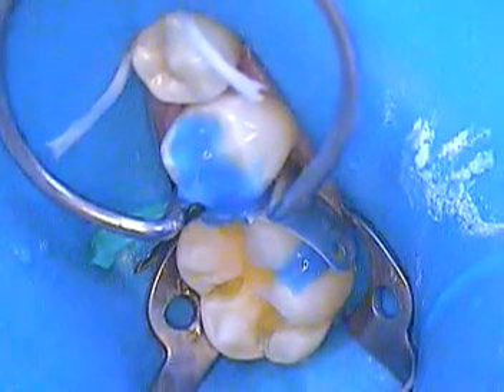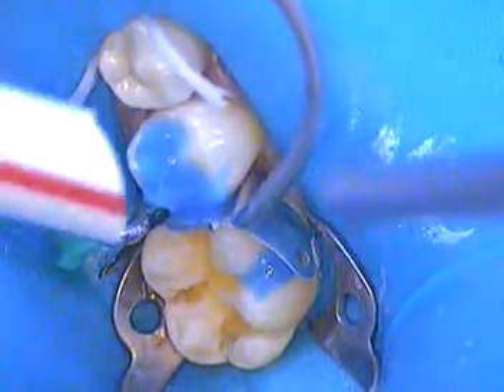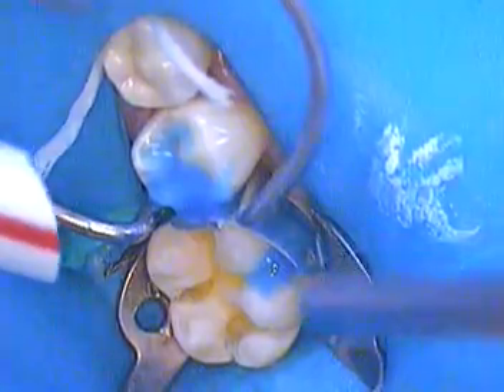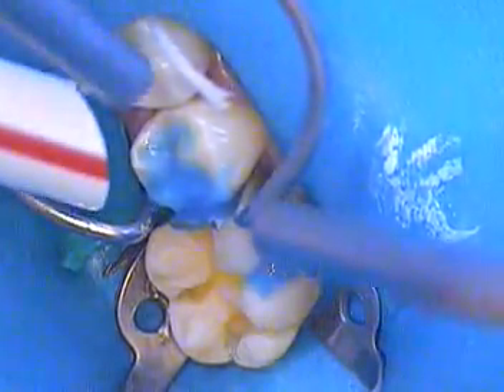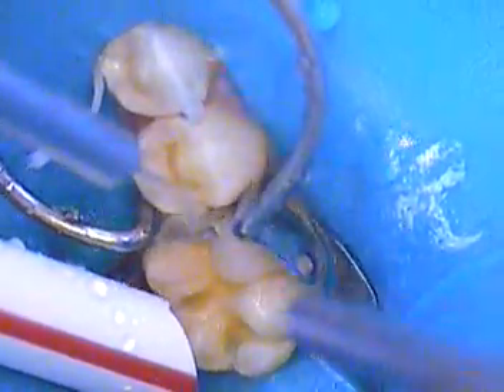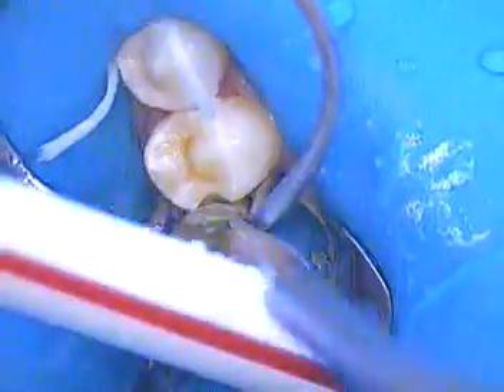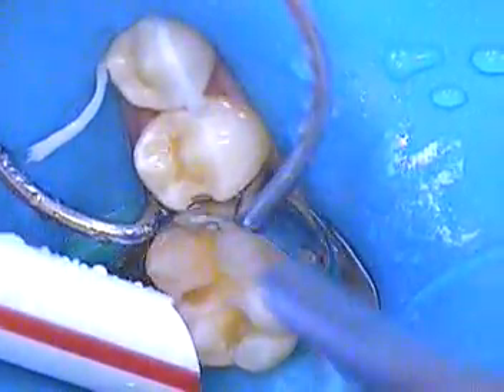We are isolated with the rubber dam and our methods are very conservative. You're now seeing the molar all cleaned out, the bicuspid all cleaned out thoroughly, and we're keeping her enamel as much as we can, staying conservative.